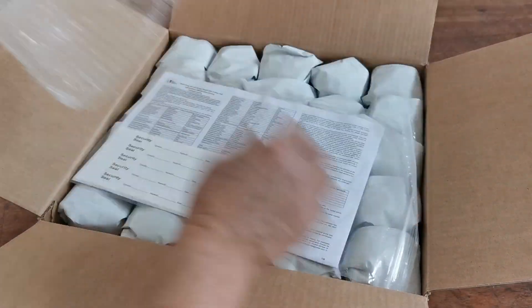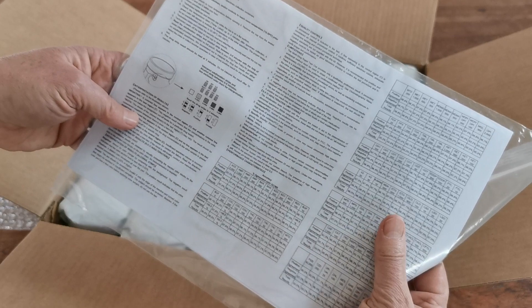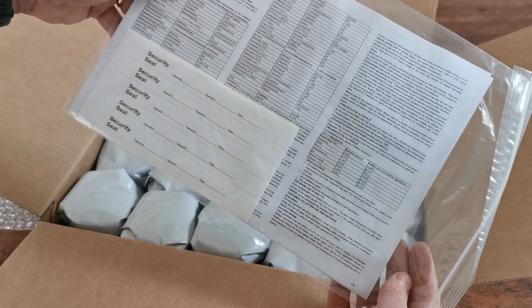Full manufacturer's data sheet with security seal labels should you choose to use them, instructions for use (abbreviated to IFU), and all the data sets on the selectivity, sensitivity and accuracy of the individual membranes shown there.